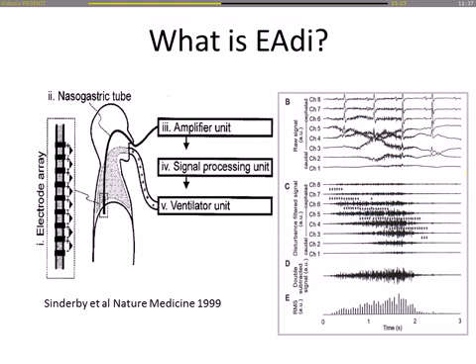I'm talking about the electromyographic signal coming from the diaphragm. You know that we have the possibility of recording and reading continuously the electromyographic signal of the diaphragm by using a special catheter and the dedicated ventilator. But in theory, this could be done independently of the ventilator.